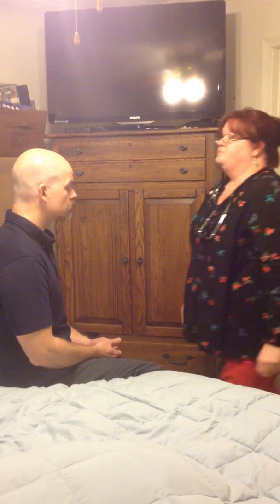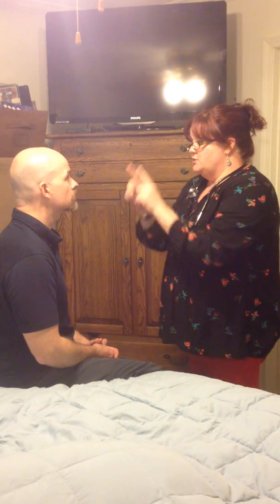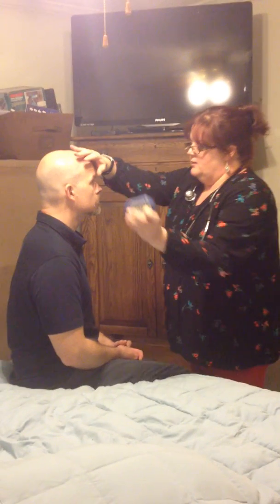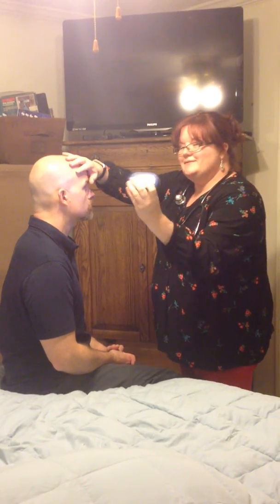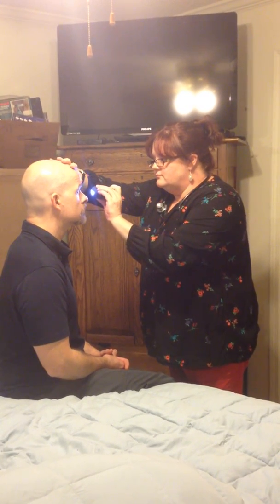Okay. So, what I want you to do is I want you to not turn your eyes. I want you to keep your eyes straight ahead. Do not turn your head. What I'm going to do first is just check your pupillary response. Okay. If I can get this thing to go, there we go. Okay. His pupils are round, equal, and accommodating light.